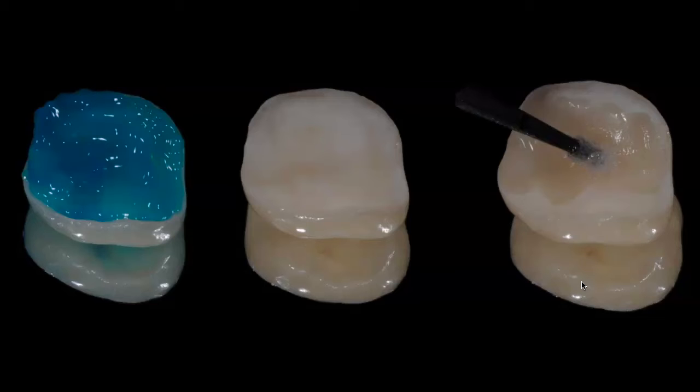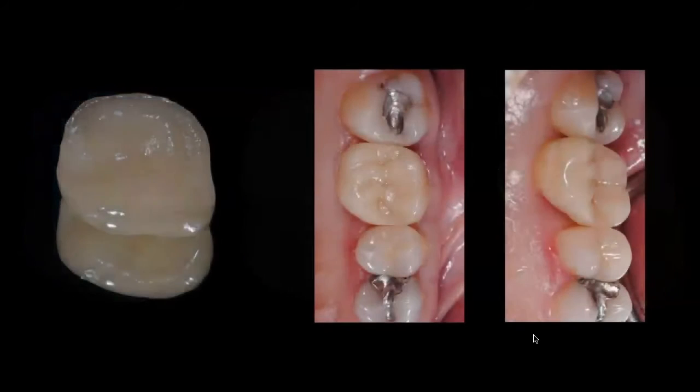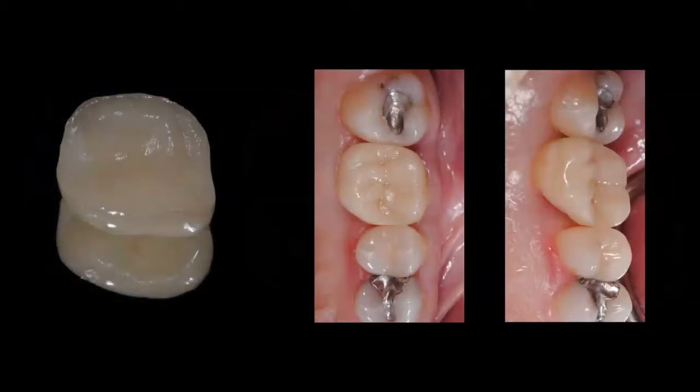Once you apply that silane, again, you want to leave the silane undisturbed in that intaglio surface for at least 60 seconds. And now what you're seeing on the left-hand side is the actual restoration, the same one that I've been sharing with you right now, completely cleaned and protected. That intaglio surface is completely protected with that silane. It's ready for the next step, which is the bonding step.